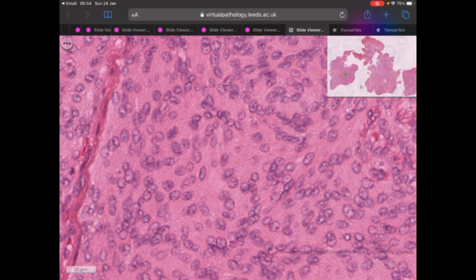This is different from the fibrillary background in glial associated tumors, which appears very fibrillar, whereas in this meningioma they appear like they are sharing this eosinophilic cytoplasm, because you can't really appreciate the outline of the cytoplasmic membrane.